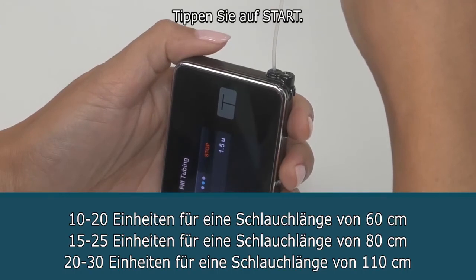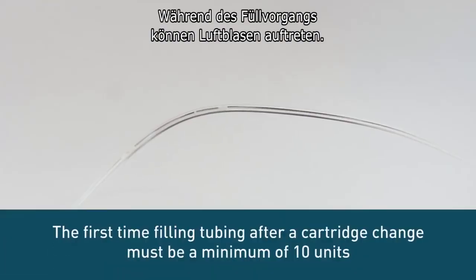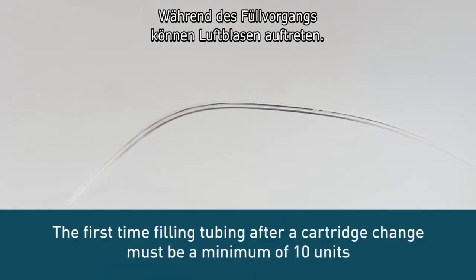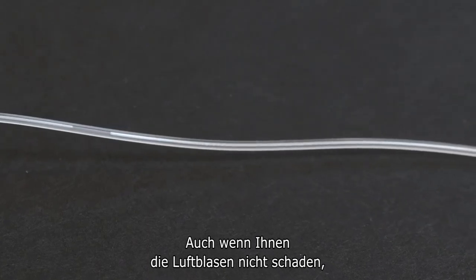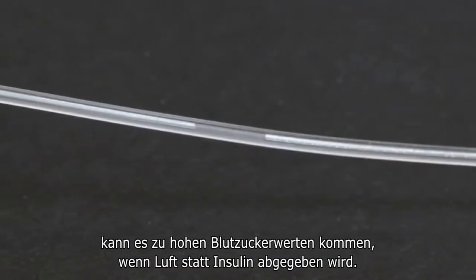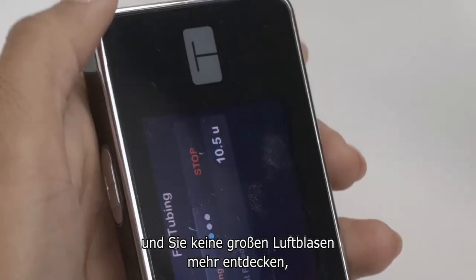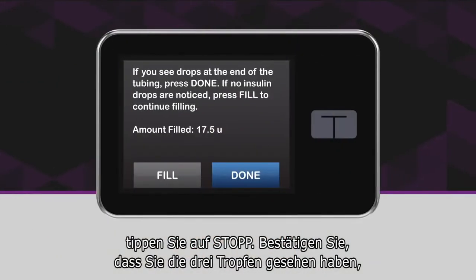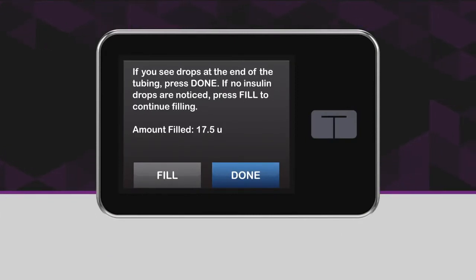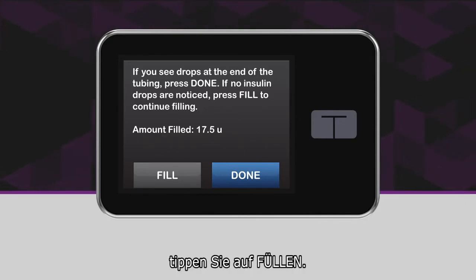Now tap Start to fill your tubing. Your pump will beep periodically to let you know that it's filling the tubing. As the tubing fills, you may notice some small air bubbles in the first few inches of insulin — very tiny ones aren't a concern, but anything larger should be pumped out. Even though air bubbles themselves will not harm you, there could be a risk of high blood sugar if air is infused in place of insulin. Once you notice three drops come out of the end of the tubing and you're satisfied that there are no large air bubbles, tap Stop. Your pump will ask you to confirm that you saw drops — if you saw drops, tap Done; if you stopped before you saw drops, tap Fill to continue.